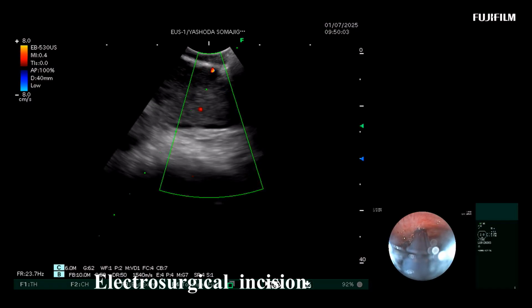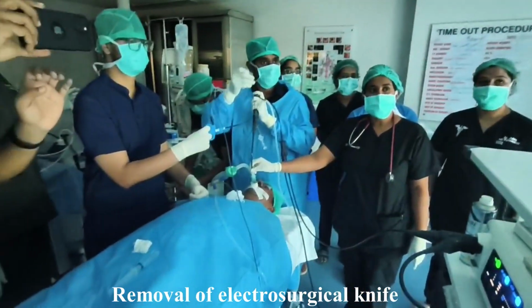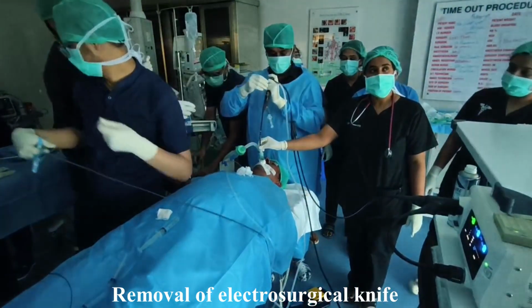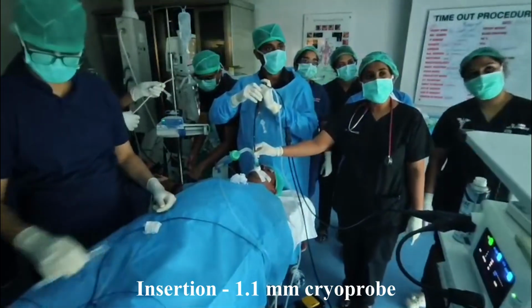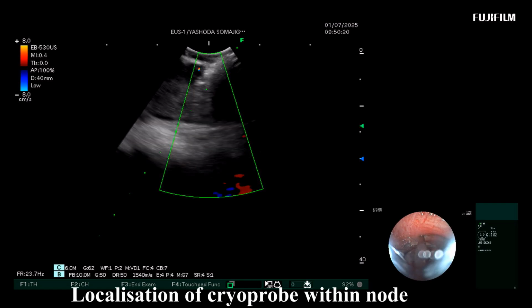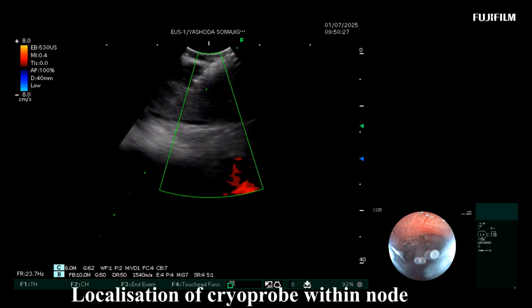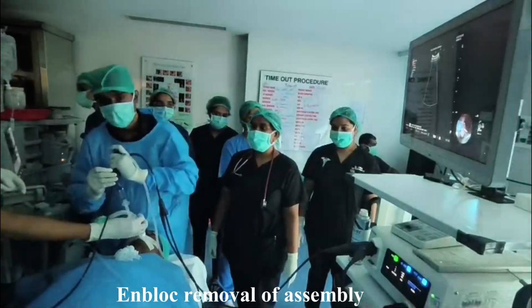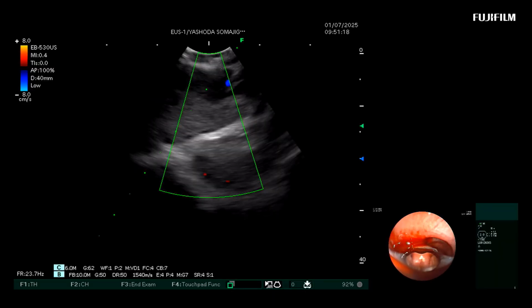lymph node. And once the capsule of the lymph node is breached, now we pass the 1.1 millimeter cryo probe through the working channel of the scope, and then we freeze it for almost around 3 to 5 seconds. And after that, we are removing the entire assembly en bloc, and this helps us to do the EBUS intranodal cryobiopsy in quite a safe manner without causing damage to the scope while inserting the electrosurgical needle, and the procedure is quite effective in getting an immediate diagnosis.